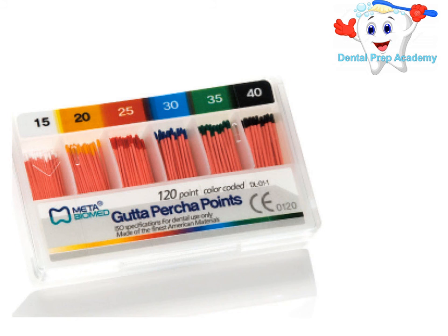So now the gutta-percha with which I would be checking the tug back would be a 35 number gutta-percha, and then with the spreader I would be confirming which spreader is able to go easily within 2 to 3mm of the working length, and then with that spreader I would start placing my accessory gutta-percha cone.